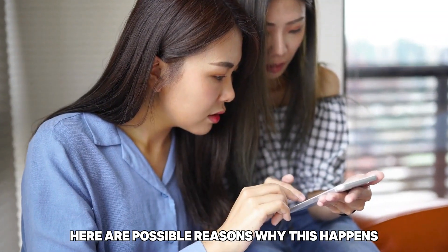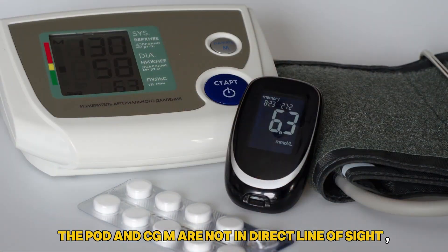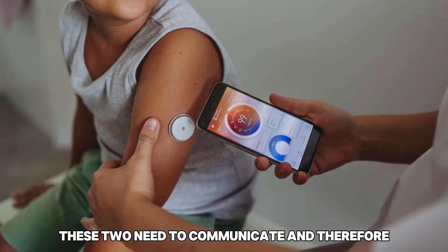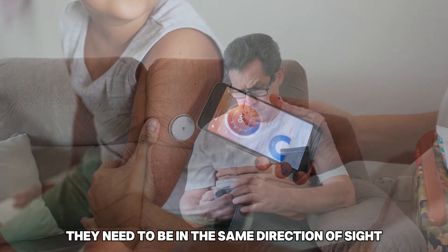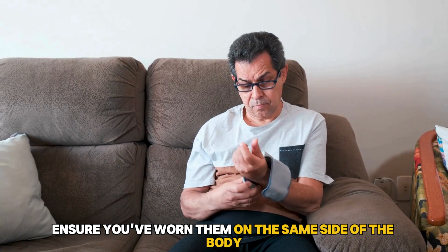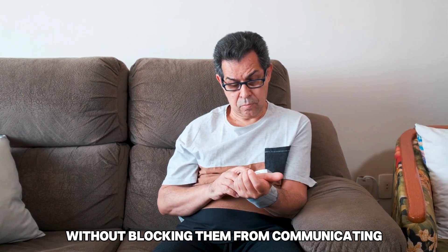Here are possible reasons why this happens and how to fix the issue. First, the pod and CGM are not in direct line of sight. These two need to communicate, and therefore they need to be in the same direction of sight. To rectify this, ensure you've worn them on the same side of the body without blocking them from communicating.